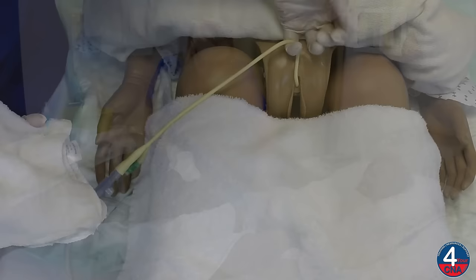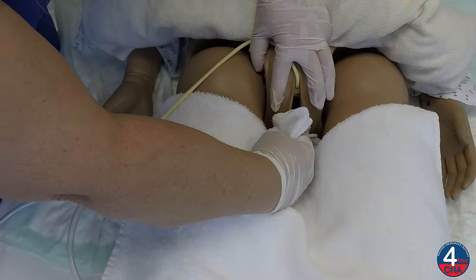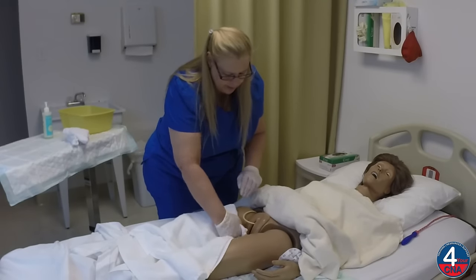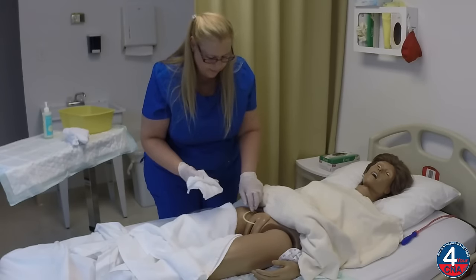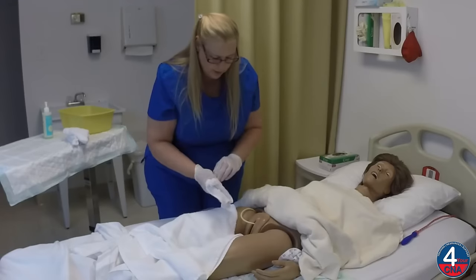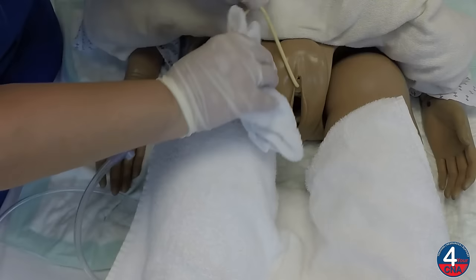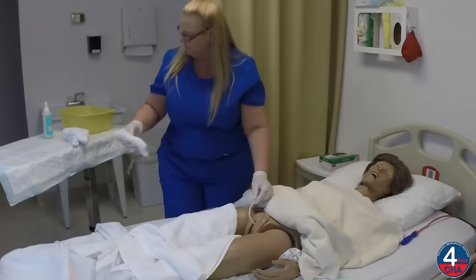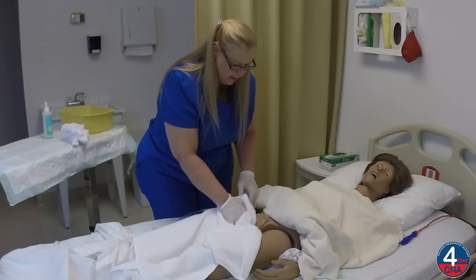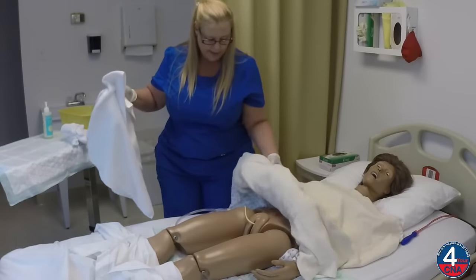I'm going to take the final washcloth and wring it out really well, and we're going to rinse all of those areas the same way that we washed them. So I'll hold that catheter out of the way and spread the labia open, cleaning down the center, top to bottom. Fold that leaf over, clean down one side of the labia, fold that leaf over, rinse down the other side of the labia, fold that leaf over. We're going to rinse the skin fold, fold that leaf over, and the other skin fold. Set that aside. Now we'll dry gently by patting dry, top to bottom, and then remove the towel.